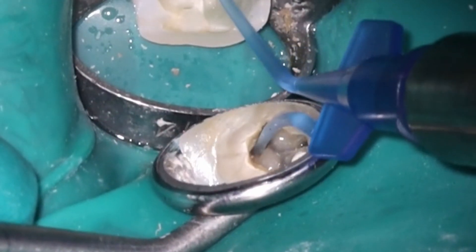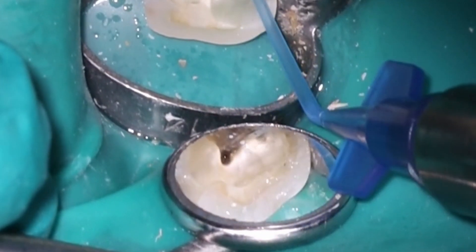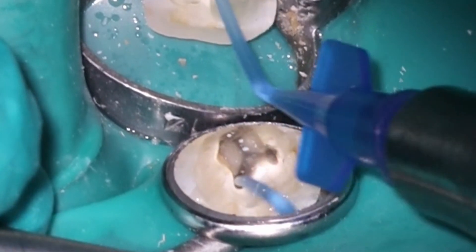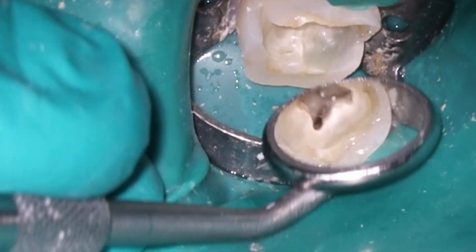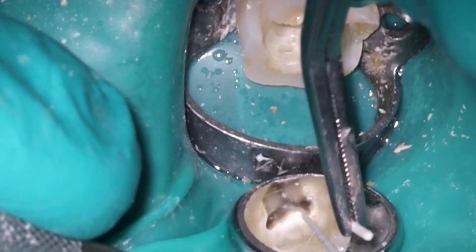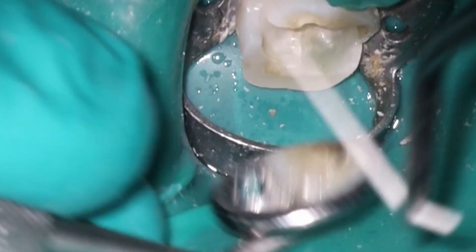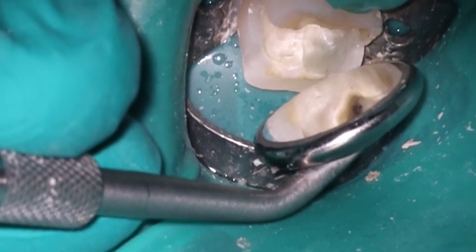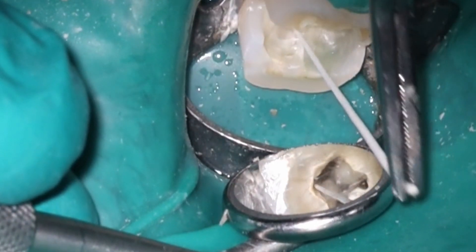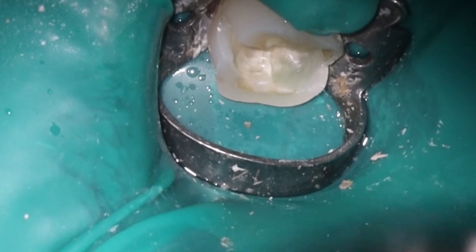Going ahead and drying things out — this is the moment of truth, going in with my micro suction to see if we can get the canal nice and dry. Really no drainage coming up from this tooth whatsoever. I've also found that when you go in with that air-only Stropko and just gently dry it, that's also a good test. Sometimes, especially near the sinus, that gentle pressure of air will actually start to cause drainage — and that's a sign that the tooth needs calcium hydroxide. Going with our paper points, we're getting it nice and dry. I always test paper points by gently pushing against the rubber dam — if it buckles, it's still wet — but these are just about as straight as when I put them in.